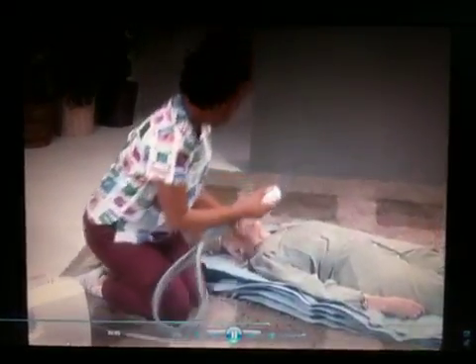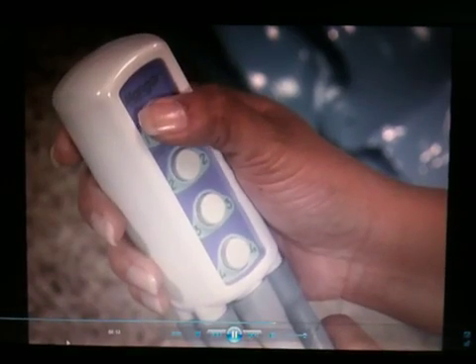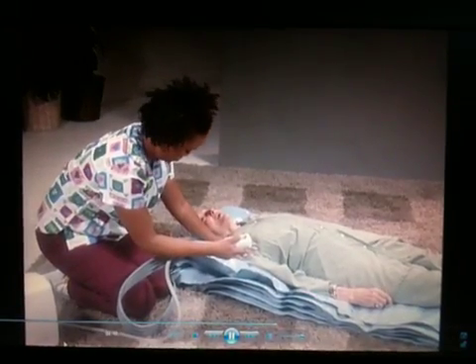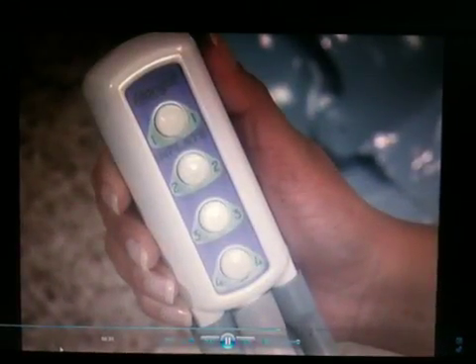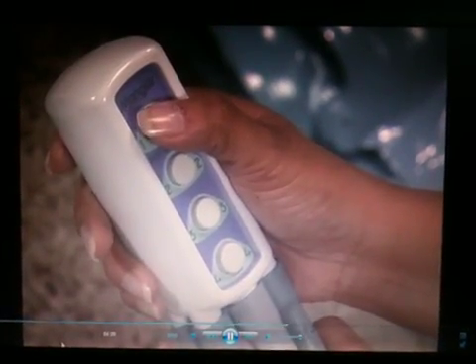Once the process has been explained, the caregiver operates the four-way handset to control the lift section by section. The caregiver gives reassuring support by placing their hand on the person's shoulder or arm. There are 4 buttons on the four-way hand control. Button number 1 inflates the head support section.